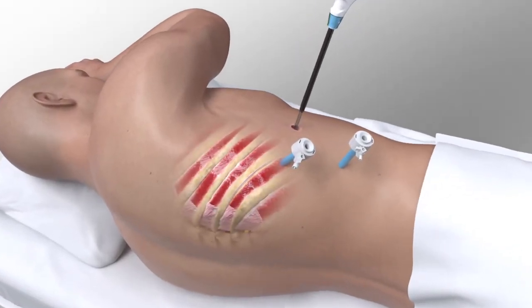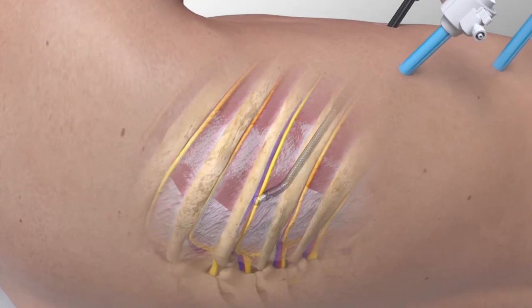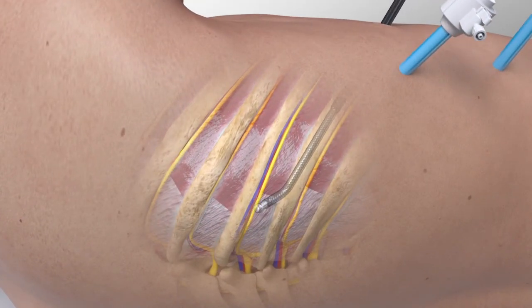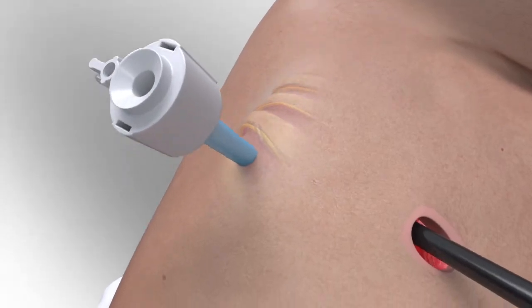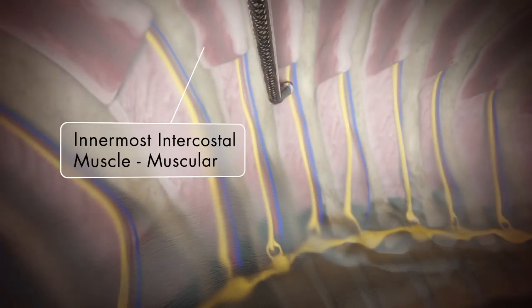Cryo ablations are performed on the intercostal bundle which contains the vein, artery, and nerve. Locate the nerve in the incisional intercostal space, preferably at the margin of the innermost intercostal muscle and the membranous portion of the internal intercostal muscle.